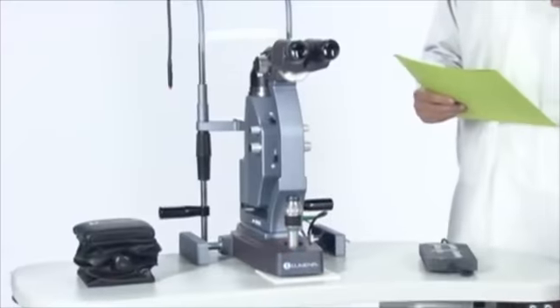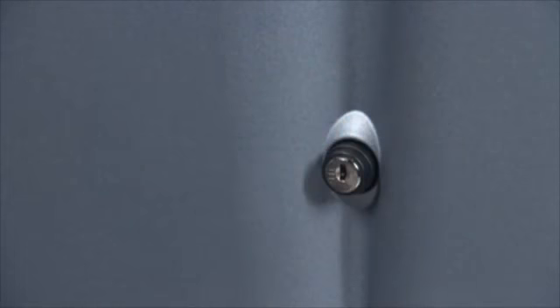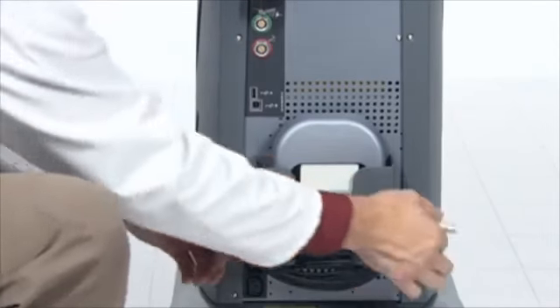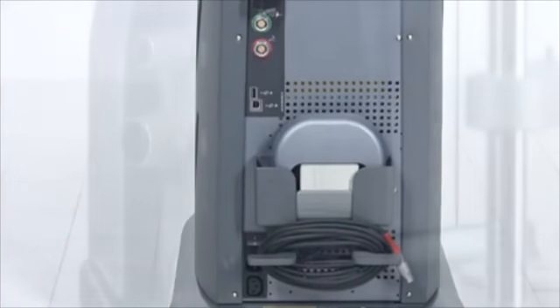When patient treatment is complete, place the laser in standby mode. Turn off the laser as demonstrated in the Laser Console Basics. If desired, disconnect and store laser and delivery device components as instructed in Laser Console Basics viewed earlier.